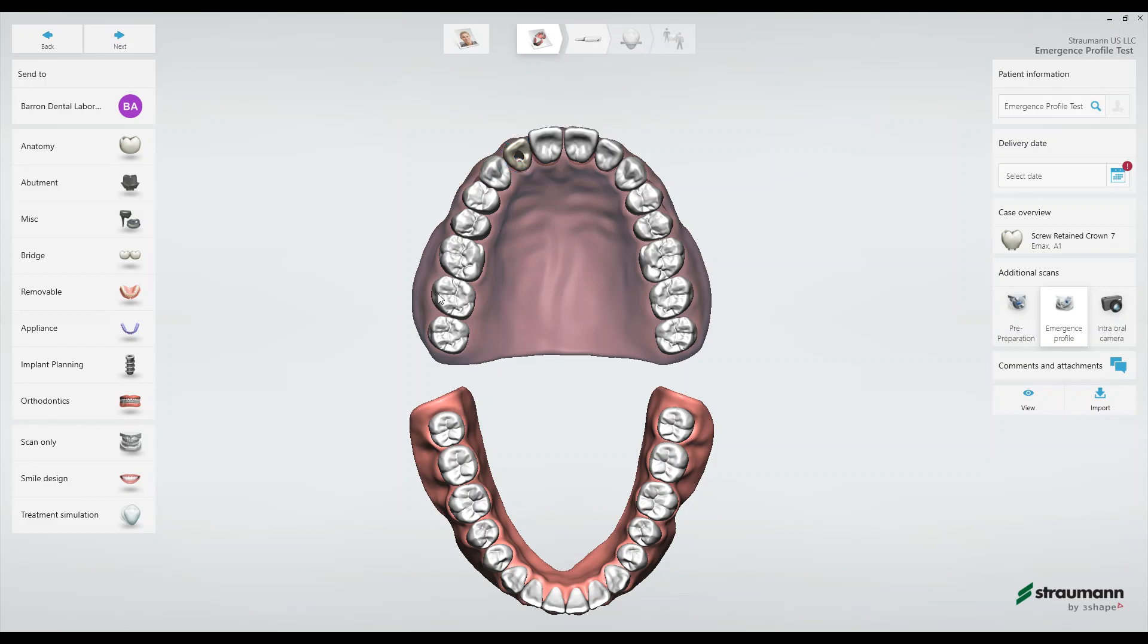One more important thing to note is over here when we have an implant scan the emergence profile is automatically selected. However, the pre-preparation needs to also be selected for this workflow. When I click that you'll see that highlight in white here.